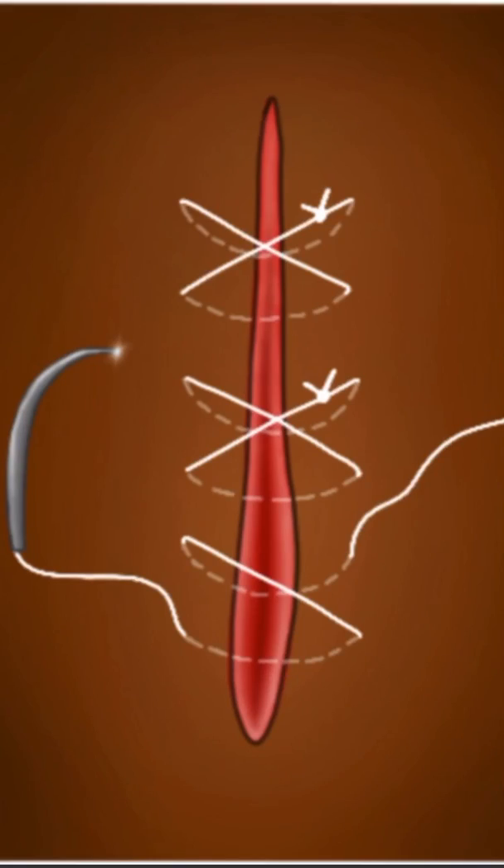Since I'm right-handed, I'm going to begin here. I'll go through the skin, through the incision, and out of the skin. Then without cutting anything, we go across and start again — through the skin, through the incision, out of the skin. Now you get two loose ends, and we're going to tie them and make a surgeon's knot right here. So again: through the skin, through the incision, out of the skin, come across, down again, through the skin, through the incision, out of the skin, and then tie these two loose ends. Now let's begin with the actual suturing process.